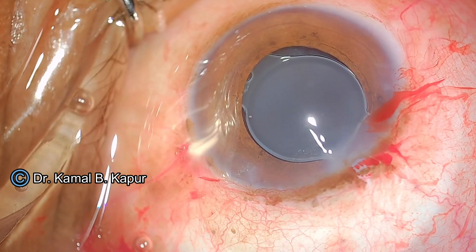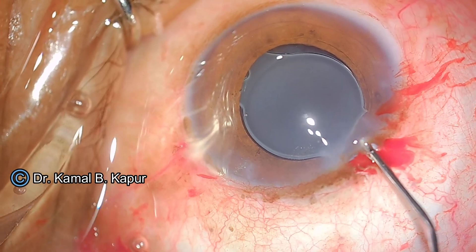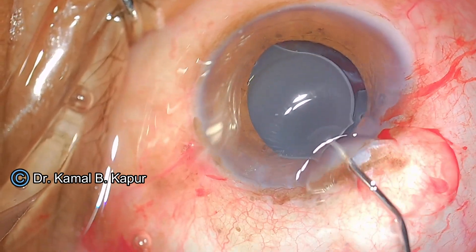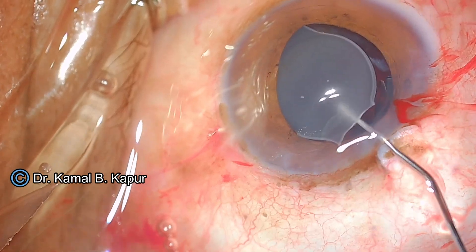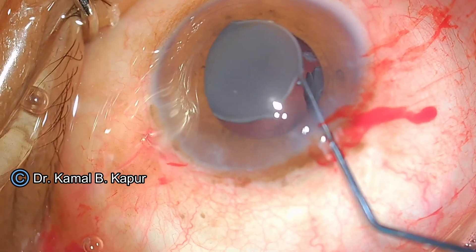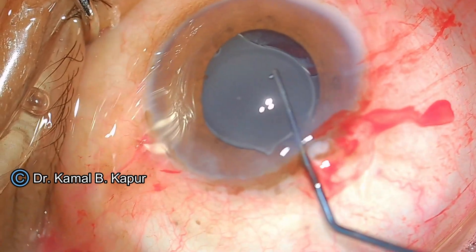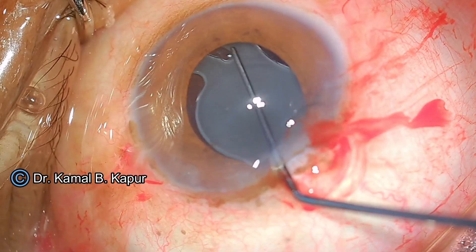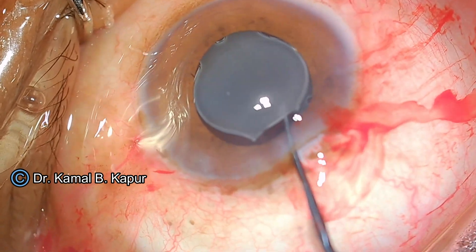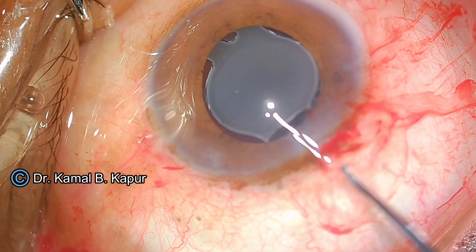The second step is cutting the IOL into two pieces. I push viscoelastic — sodium hyaluronate — behind the IOL, while the endothelium is coated with methylcellulose. I align the IOL along the straight axis where I want to cut it. Since I already encountered difficulty inserting the cutter with the sleeve, I will slightly enlarge the wound.